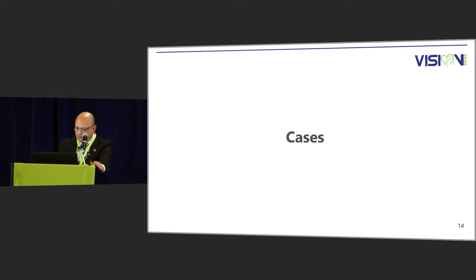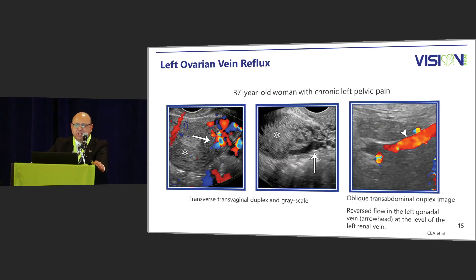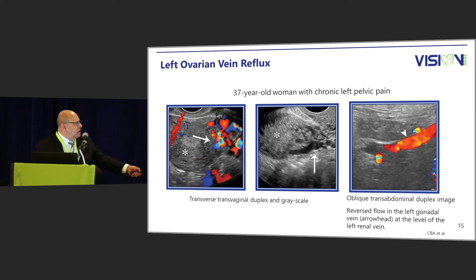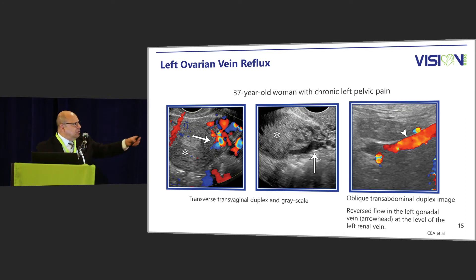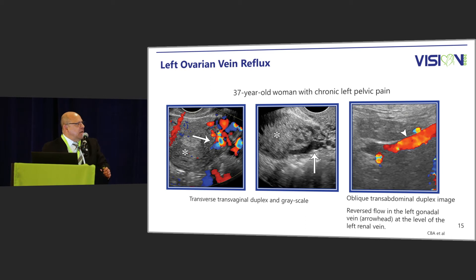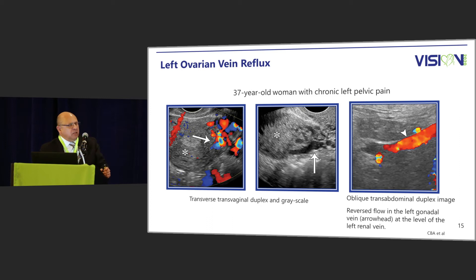This is a 37-year-old woman with chronic left pelvic pain. On transvaginal ultrasound you can see the colored dilated pelvic veins in the left parametrium space. The asterisk demonstrates the uterus and on grayscale you can see the large hypoechoic vessel. On duplex imaging, the dark hypoechoic area represents the left renal vein, and the red portion demonstrates that flow is away from the renal vein, indicating venous insufficiency or reflux.